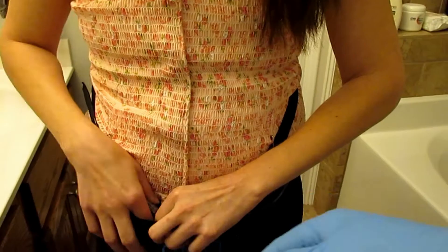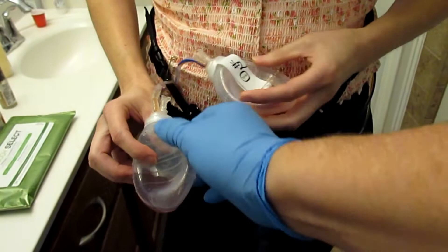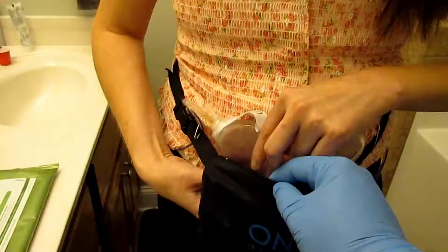The drains are little bulbs and they're numbered — she's got four, so you've got number one, two, three, and four. The tube comes down into the bulb, and then there's a spout on the top which just opens up and then you drain it. To keep suction on it, once you drain it out, you squeeze it and then put the stopper back in before closing, and that keeps suction on the tube underneath.